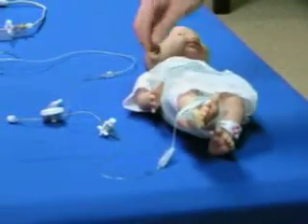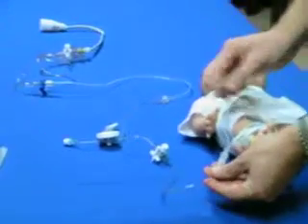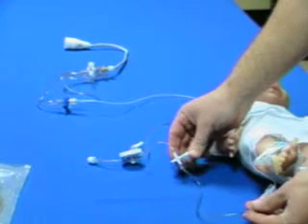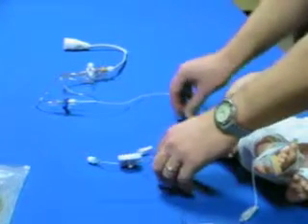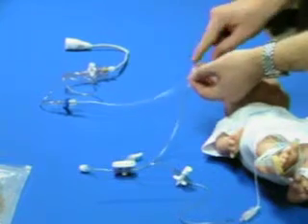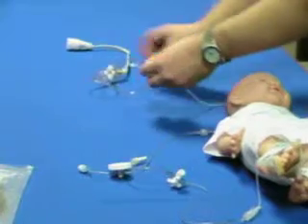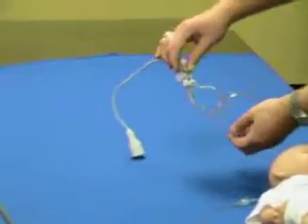Now while it's on the patient, we've got this connected directly to the UAC. Trace this back, you've got stopcock where you can take additional labs from. And then we've got our dial. It's eventually going to go into the sensor holder. You've got your transducer, and we trace that back to our transducer, which is running our fluids that we've always run.